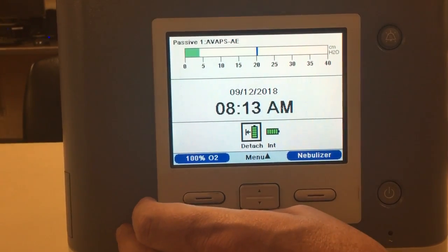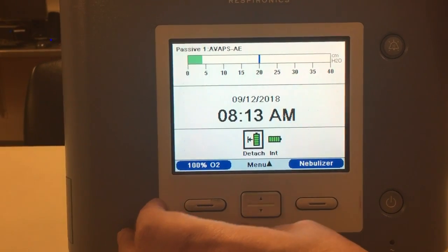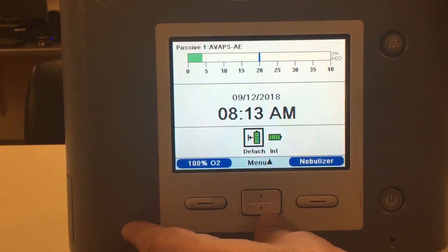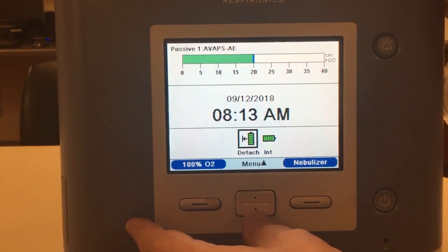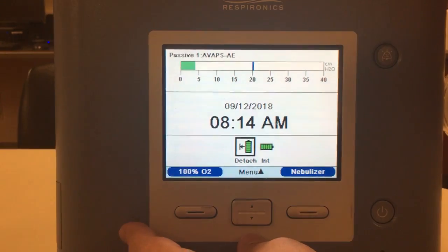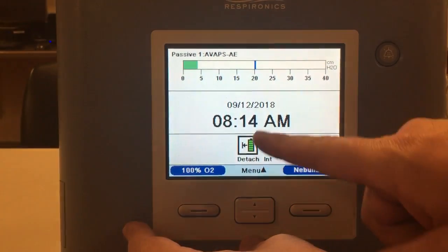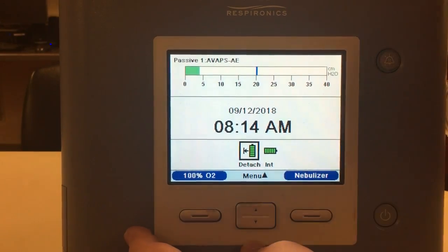Now, a lot of times, patients at home aren't going to need to see all of that, and sometimes it could even lead to greater anxiety if it's not a clinical person. So that's why a lot of times home care providers will leave the machine as is right now, just with the clock showing. And of course, it has your battery life and things of that nature.